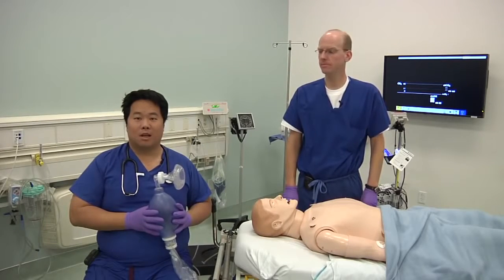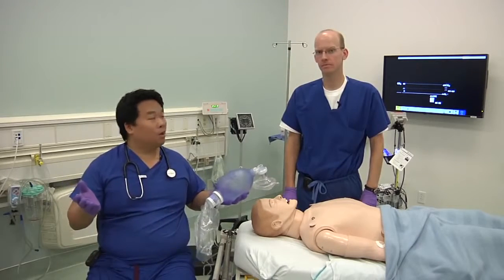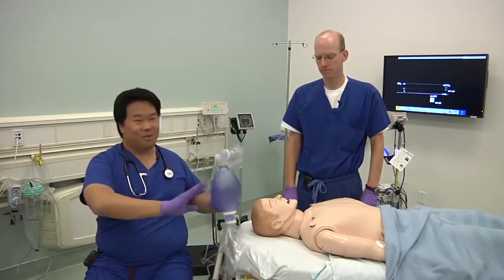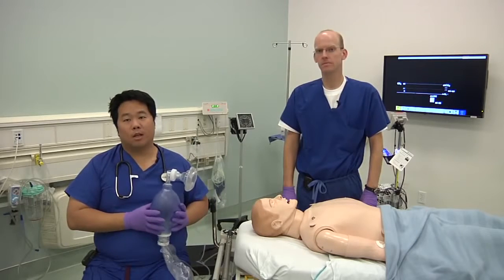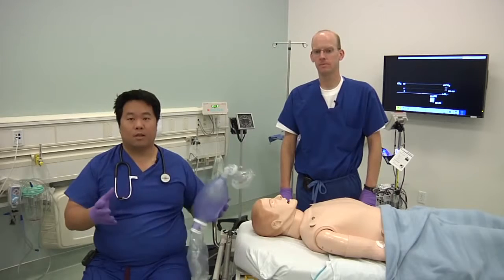So one of the things that we thought we'd show you first is the correct way to manage an airway when you have time and it's not a crisis. This is not the way to do it. And then after that, we can compare and contrast how airway management differs when you're in a crisis and you're doing chest compressions.